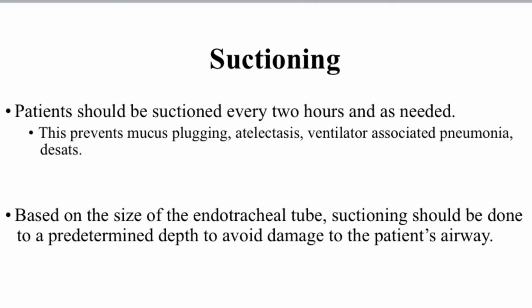Suctioning. Patients should be suctioned every 2 hours and as needed. This prevents mucus plugging, atelectasis, ventilator-associated pneumonia, and desaturation events. Based on the size of the endotracheal tube, suctioning should be done to a predetermined depth to avoid damage to the patient's airway.